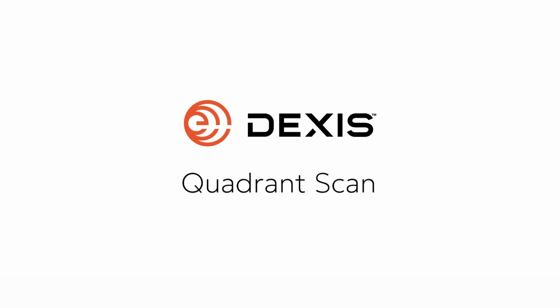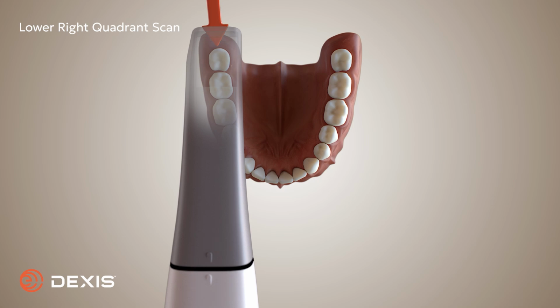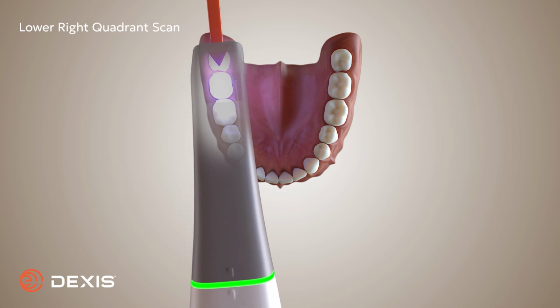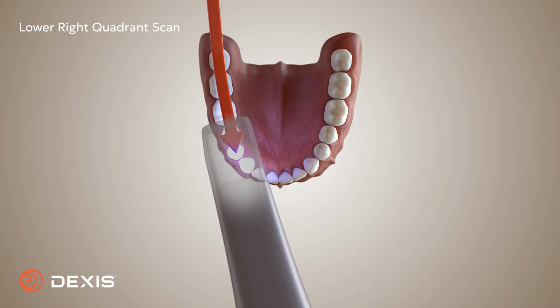Quadrant scan, lower right quadrant. We'll begin with a quadrant scan of the lower right arch. Start by resting the scanner on the occlusal surface of the last molar. Glide the scanner from the molar toward the canine, maintaining light, continuous contact with the occlusal surfaces.